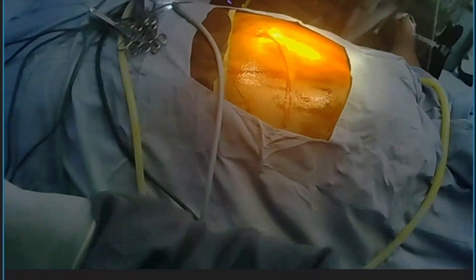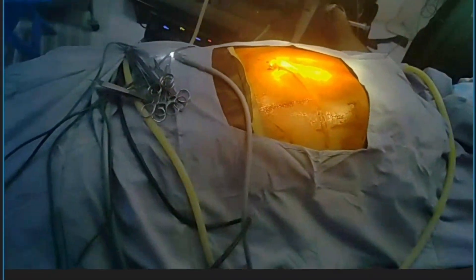This is a 60-year-old male patient, tall. We have given spinal anesthesia. You can see both the legs are suspended here.